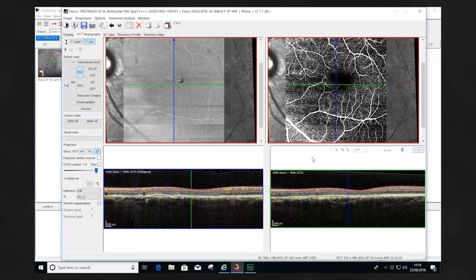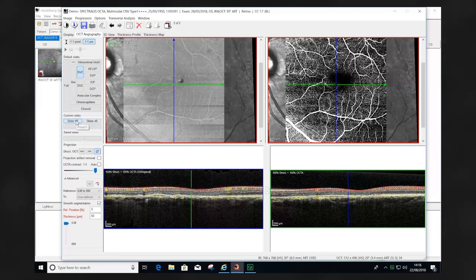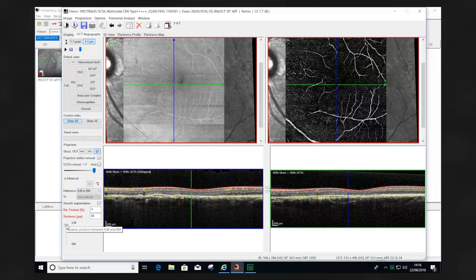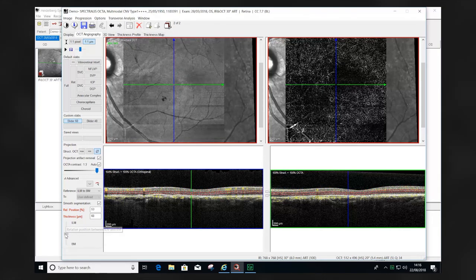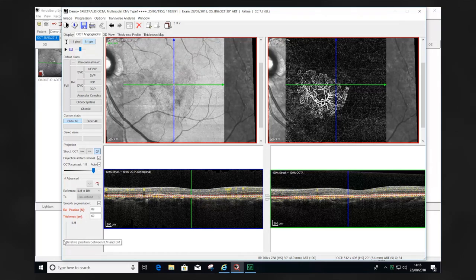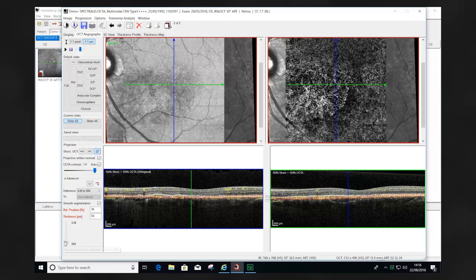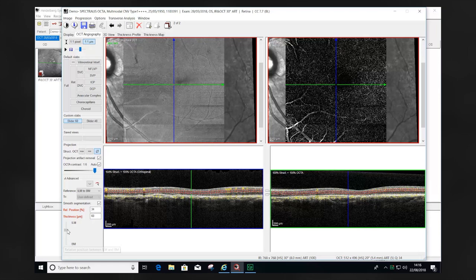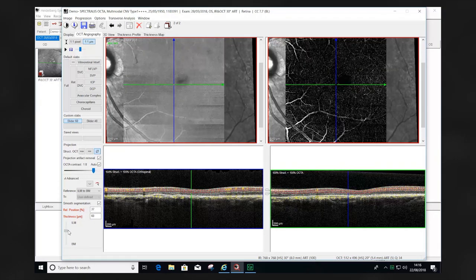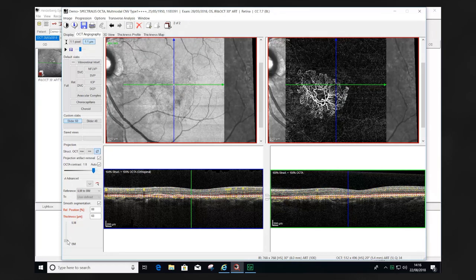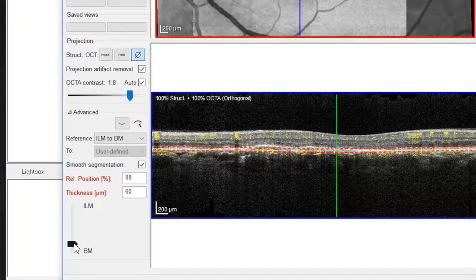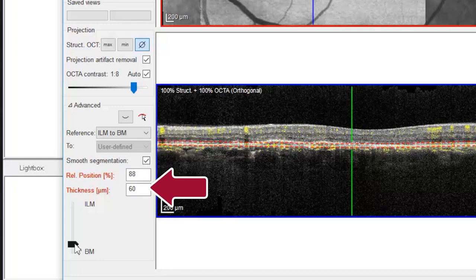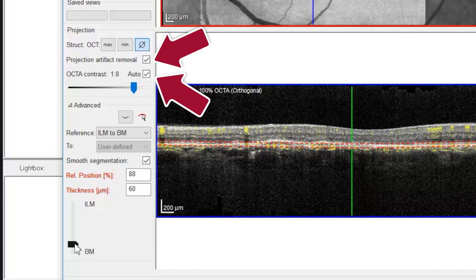The slider tools use adaptive segmentation. The scan profile changes from the ILM position through to the Bruch's membrane position. In patients with pathological change, the retinal architecture is often disrupted, causing inaccurate segmentation of the OCTA image. Using the slider tool, this dynamic approach allows the appreciation and visualization of pathology more accurately than using the conventional predefined segmentation. The slider tools need to be set up using the reference position ILM to Bruch's membrane, setting a thickness slab of either 60 or 40 microns, and ensuring that the projection artifact removal software and the automatic contrast are engaged.